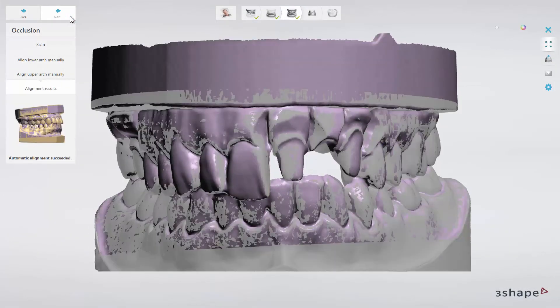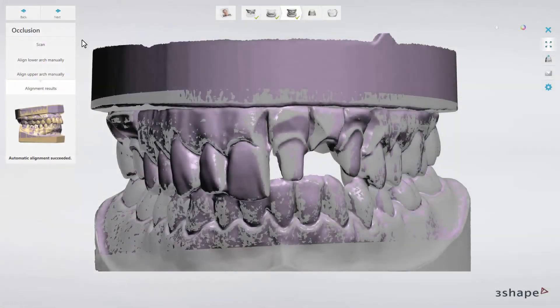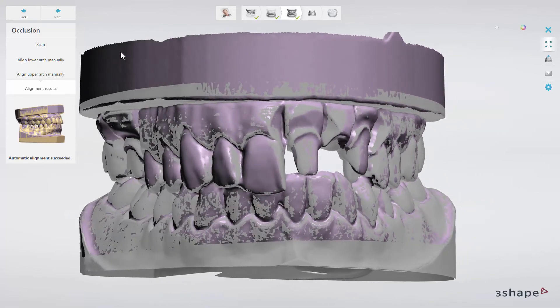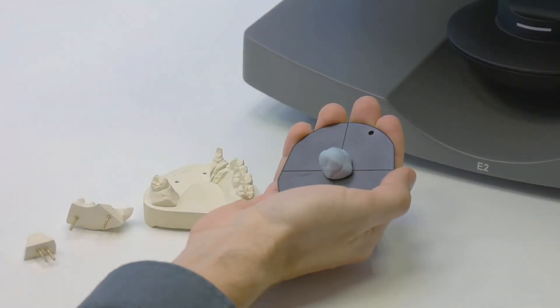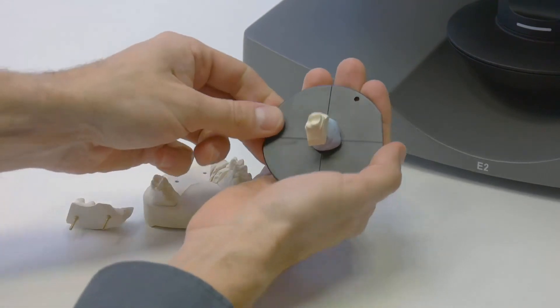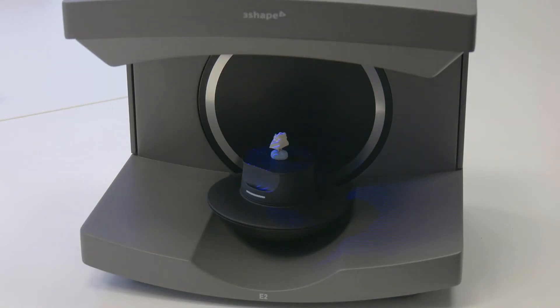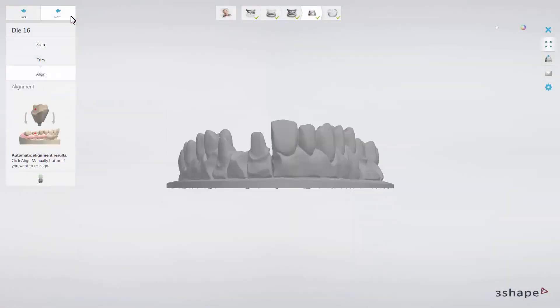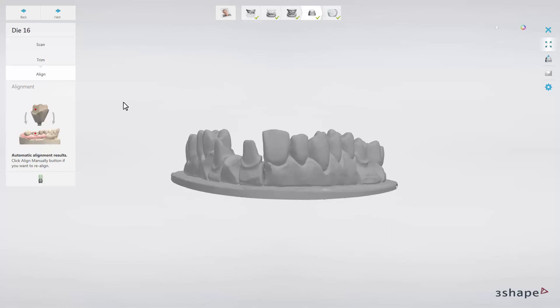You can now review the bite alignment and remove the models from the scanner. After that, click Next to proceed. The next step of the scanning process is to scan a single die. Remove the die from the preparation model and place it with the BluTac in the centre of the plate. Insert it into the scanner and wait until the scanner starts scanning if the Auto Start option is enabled. After the scan, you can check the alignment of the die within the model. After the alignment has been performed, remove the die from the scanner and click Next to proceed.